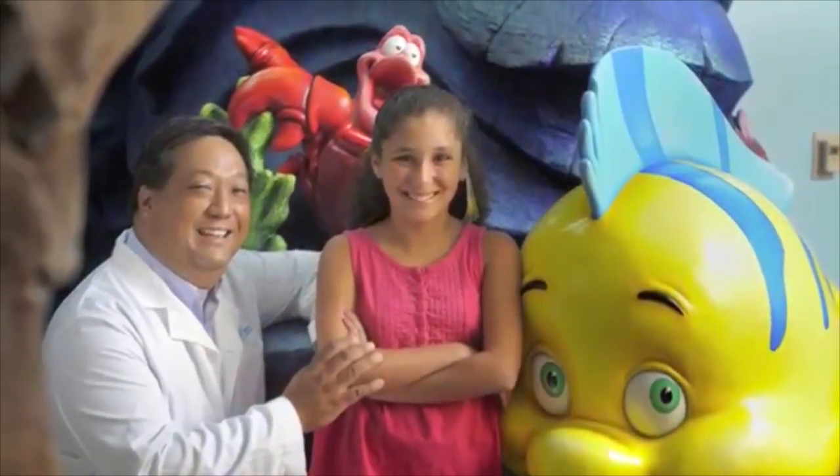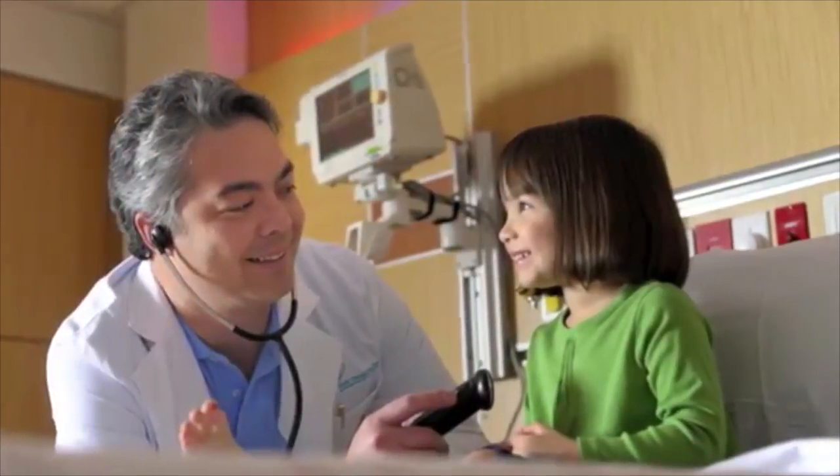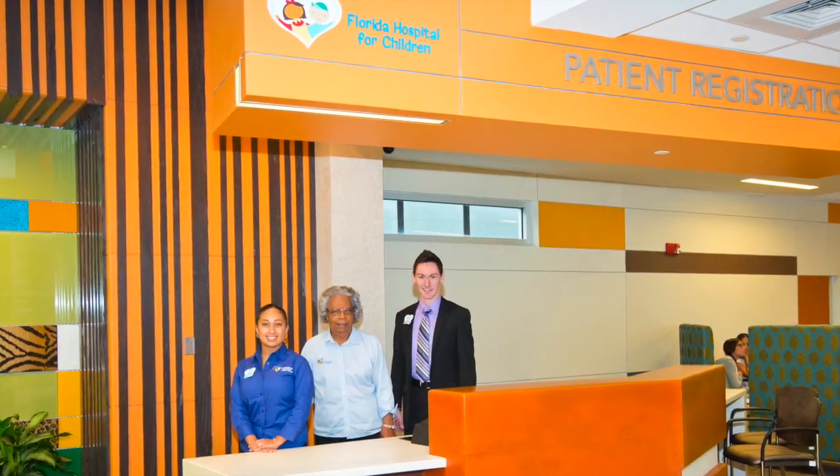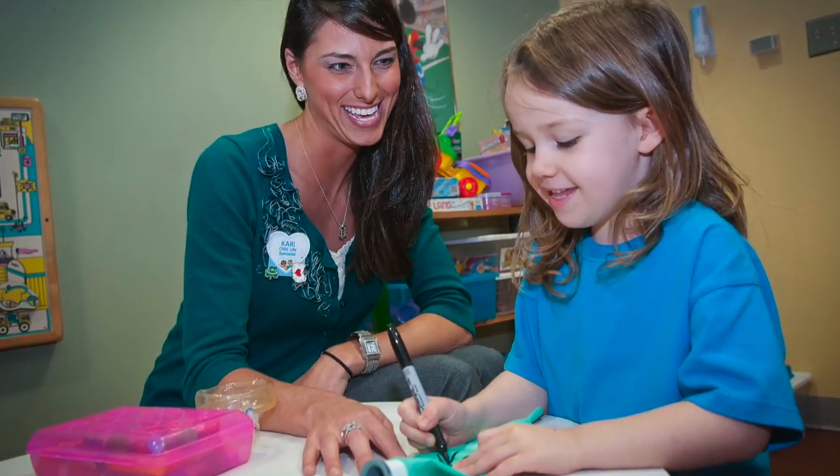When you get to our children's hospital, you'll meet a lot of new people who love working with children. They are really nice, and they'll make sure you have everything you need while you're here. The first person you meet will help get you checked in. Next, you get to go play in our playroom.